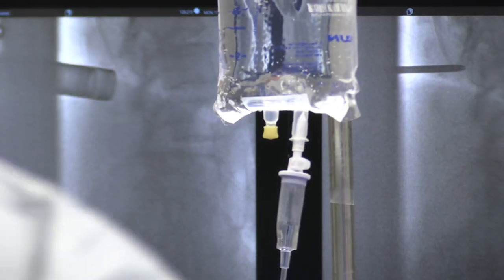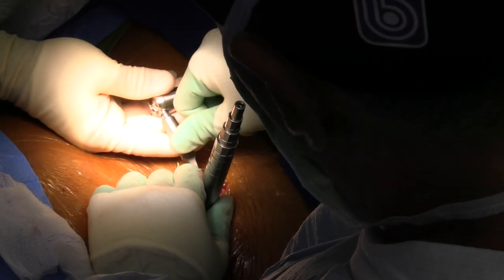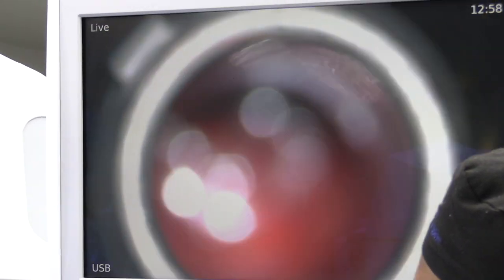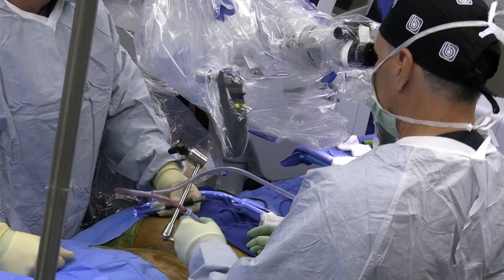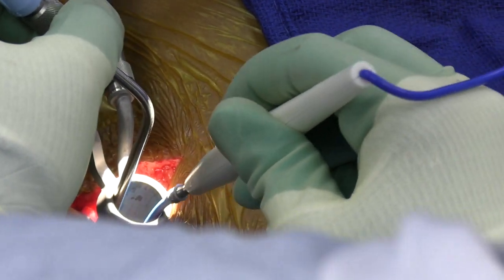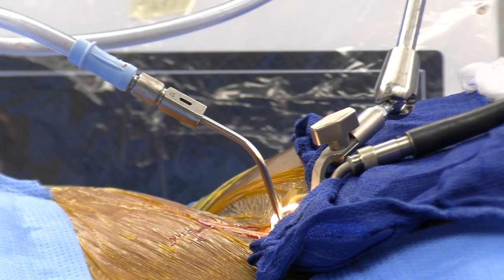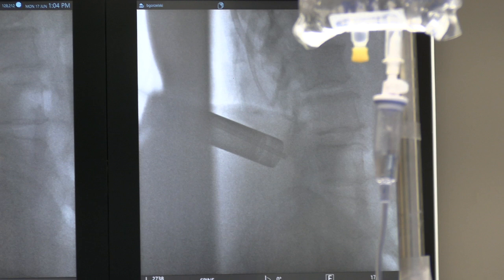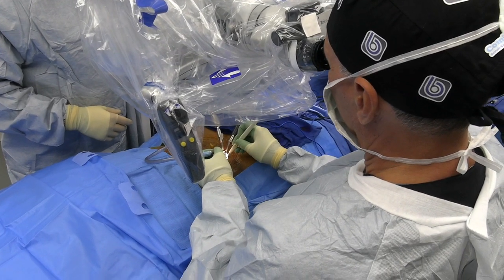So let's put a spinal needle in until I feel the bone. We're going to need a 90 by 18. I think a lot of these people who have spinal stenosis come in doing fine, probably ruptured a disc or had a disc that just protruded a little more — and that's probably why they went from asymptomatic to symptomatic. So now we're just dealing with the spinal muscle and getting down to the lamina, confirm the level with x-ray and by whatever means. Now you just get that exposed and start working up, and from here I work lateral on the lamina.